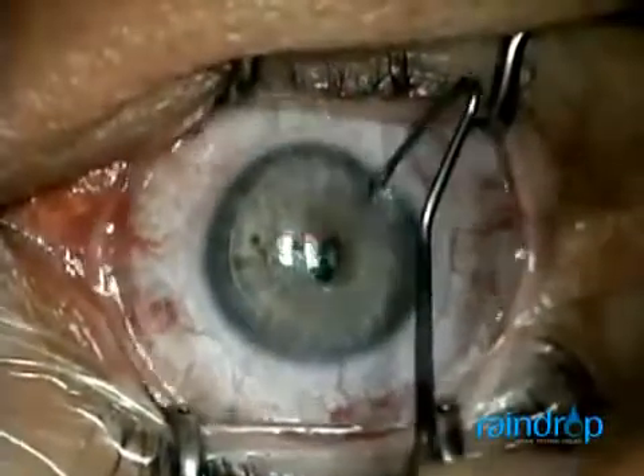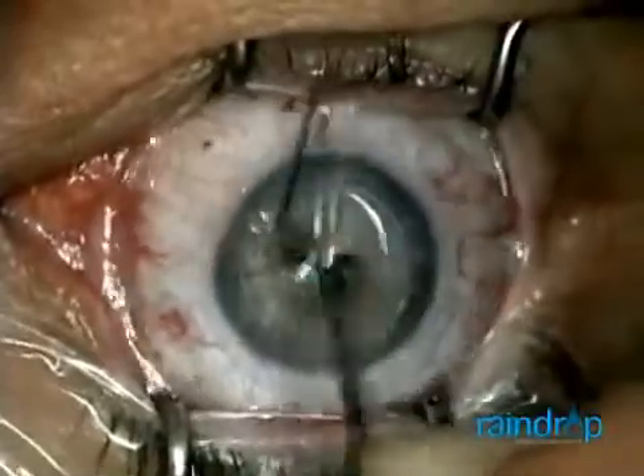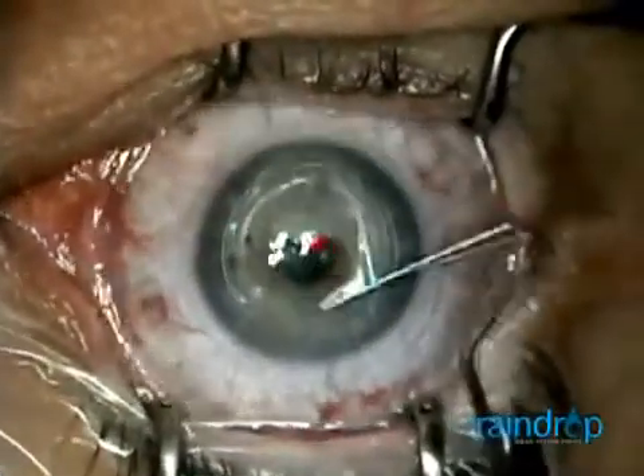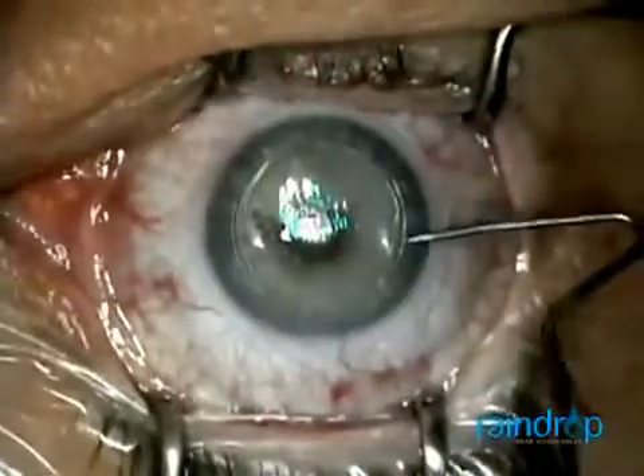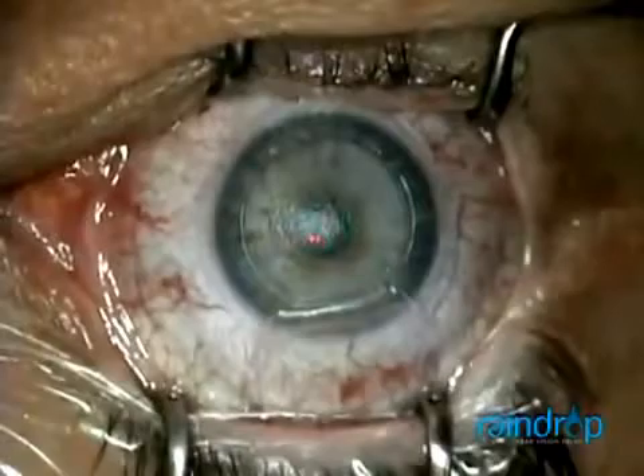First, I perform an 8.5 millimeter interlaced femtosecond laser flap targeting 160 microns depth. Once I lift the flap, I will place the raindrop inlay on the dry stromal bed and easily center it over the constricted pupil.